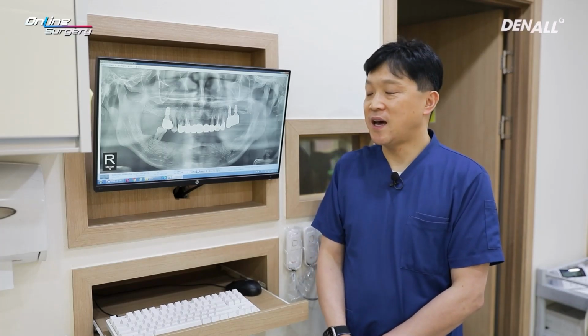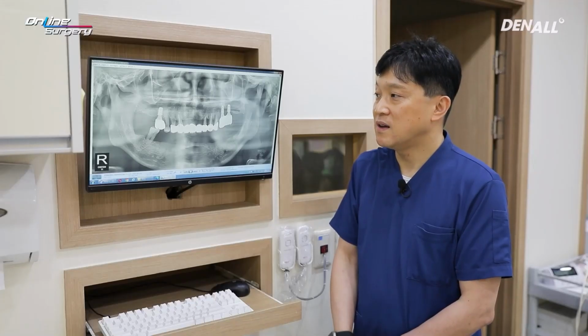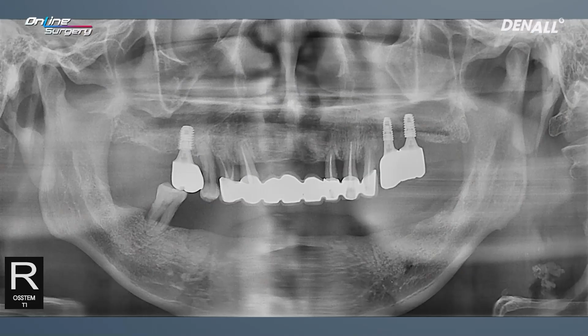Today, we're going to look at this case. It is a full mouth case in the lower. In the case of this patient, there's only number 46 remaining. After extraction, the patient has been using temporary denture. Gingival healing is somewhat complete, and now we will proceed with surgery.